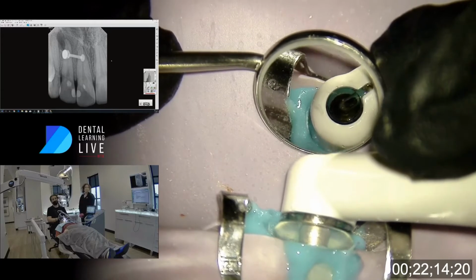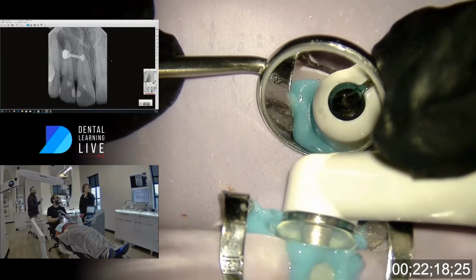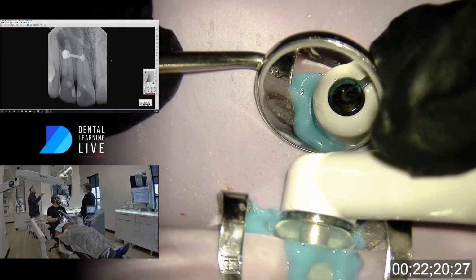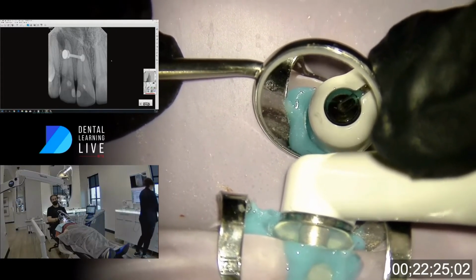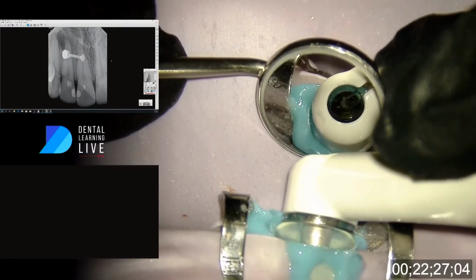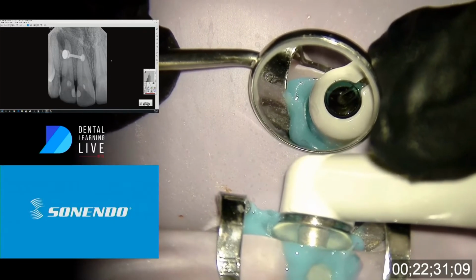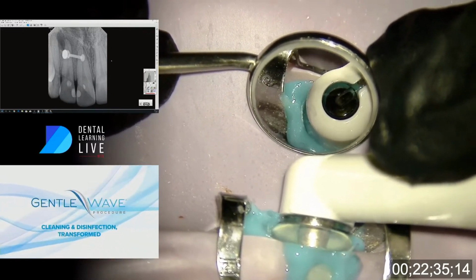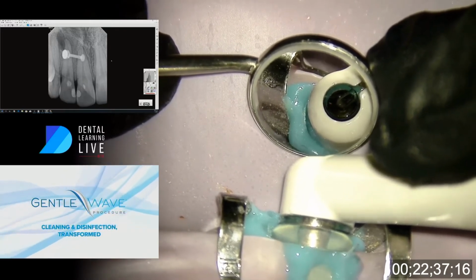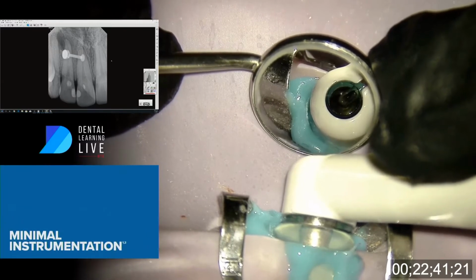And that's where we get the energy from to clean and disinfect. If you want to go ahead and play the video, we can. Corporate's got kind of an explainer video. And what that's doing then is, that mechanism of action is true of any liquid. So right now it's going through the sodium hypochlorite, but it's true if it was using water. It would create that same cavitation cloud and generate the same mechanism of action.